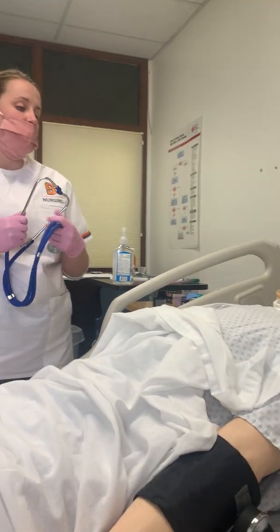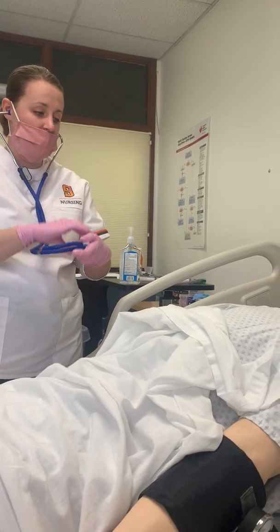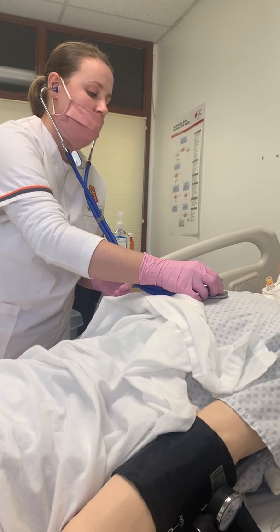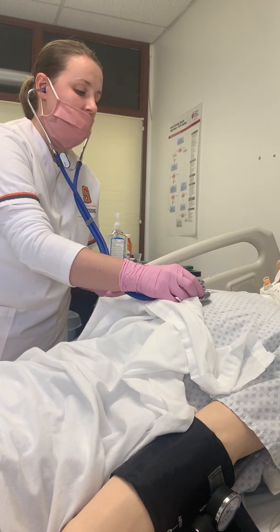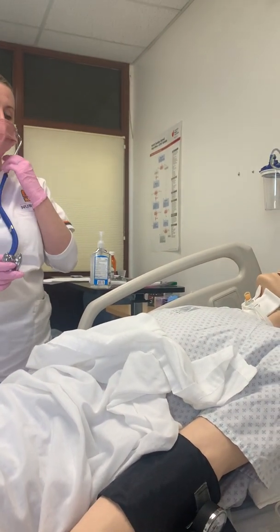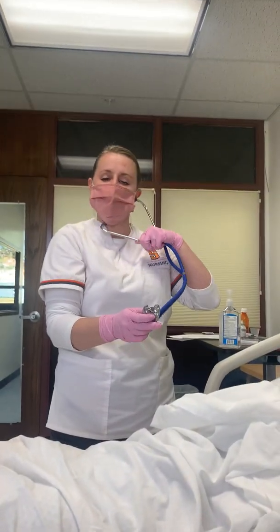I'm going to listen to Addie's respirations in 12 different places, all the way down, and her breath sounds are normal. I sound so weird with that.